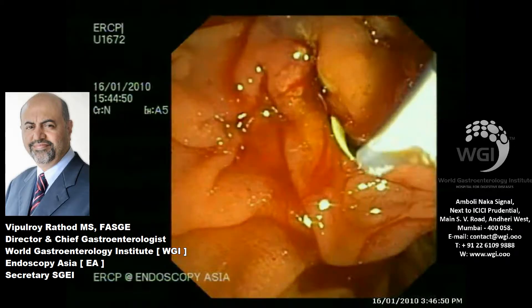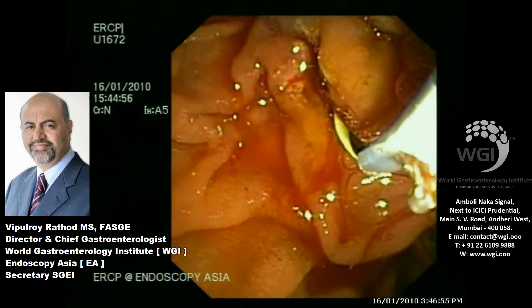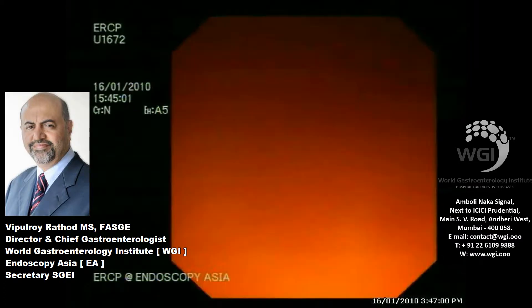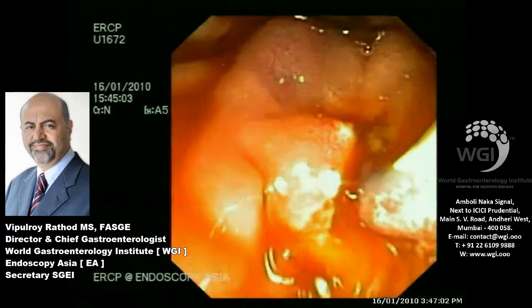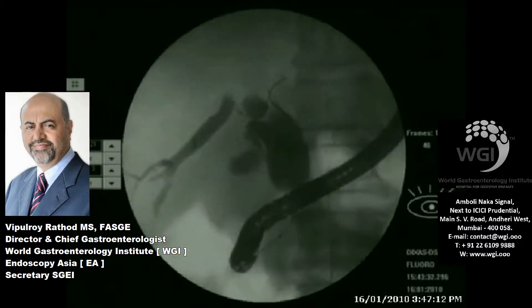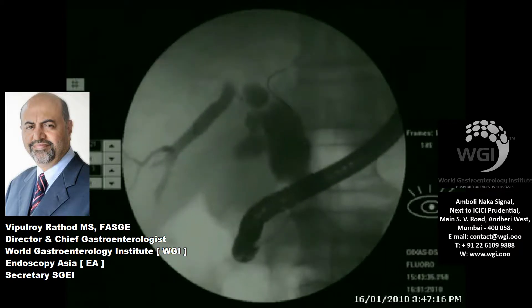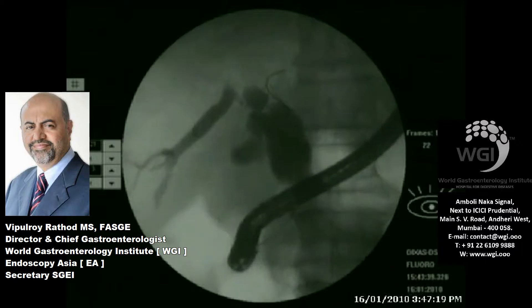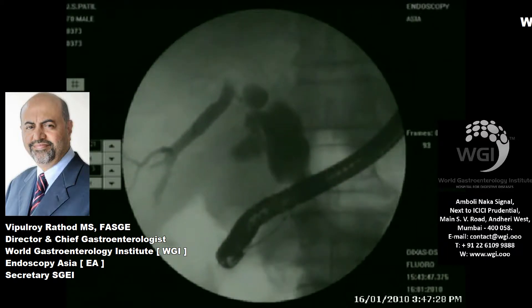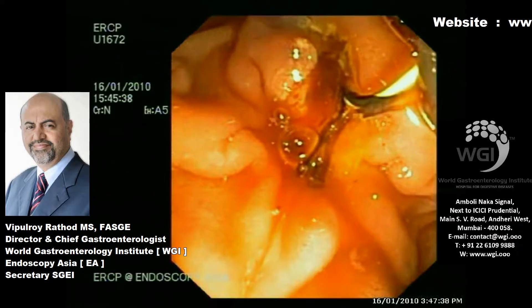This patient, as noted, has minimal free fluid. You can see the brush — it is standard practice in our study protocol that every patient with obstructive jaundice undergoes EUS-FNA as well as brushing. We have compared our data and there is no doubt that EUS-FNA is much, much superior and more accurate. Slowly and surely, as more centers start doing EUS-FNA routinely, the practice will change significantly.